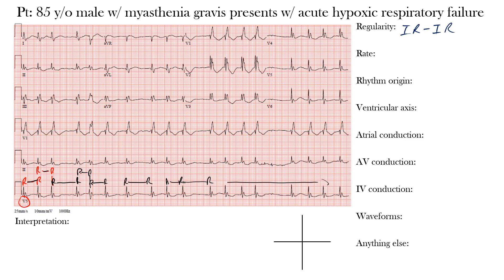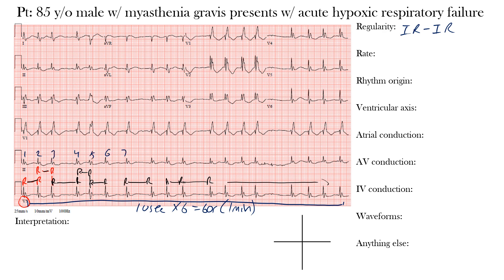Because we have an irregular rhythm, we estimate the heart rate by counting the complexes across the EKG and multiplying by six. The entire EKG represents 10 seconds, and 10 seconds × 6 = 60 seconds, or one minute. Counting the complexes across gives us 18, and 18 × 6 = 108 beats per minute. The actual EKG machine gave a reading of 105 bpm — quite close. So we have a rate of approximately 105 beats per minute, which is above 100.